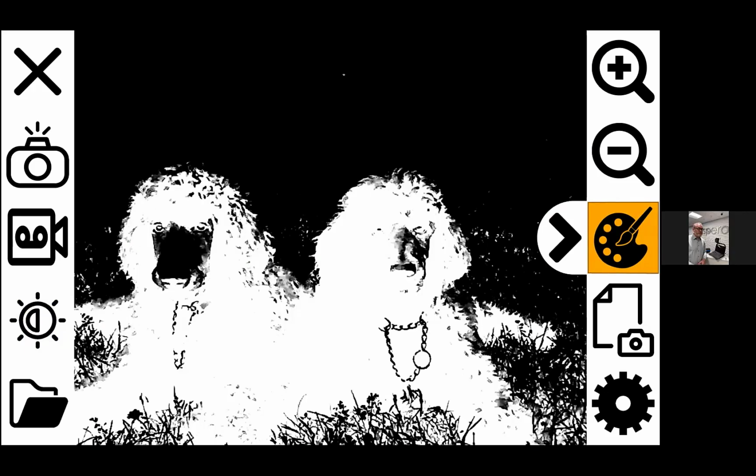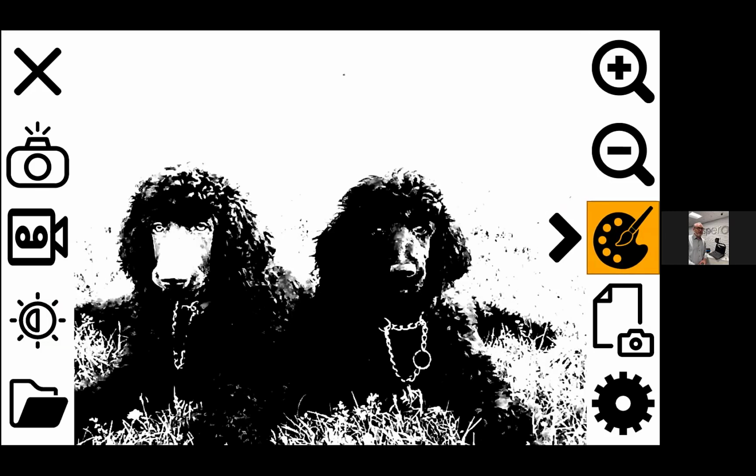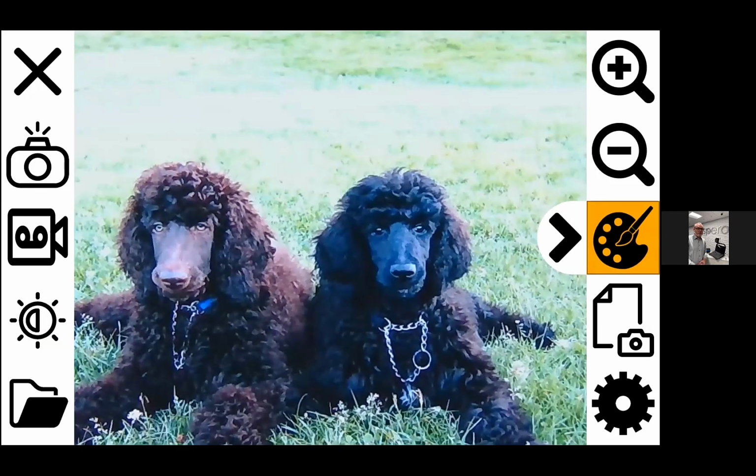Too easy to get caught in over adjusting something and then not seeing anything on the screen and not quite knowing how to get back to where you were. So exactly. That's a nice quick way of resetting where you were.